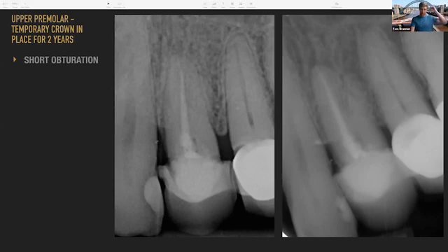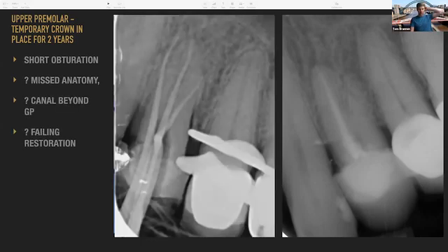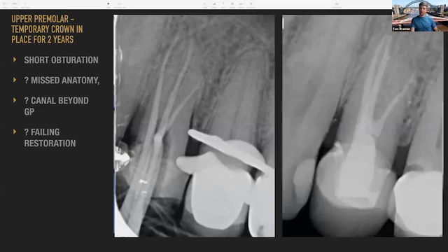And I think certainly when you look on the master cone radiograph, we can really see that this is why people have struggled initially to find what they thought was the buccal canals, actually, because there's 2 buccal canals and they do sort of split and go off. And then you've got that obturated, a better core, and then a new temporary crown.